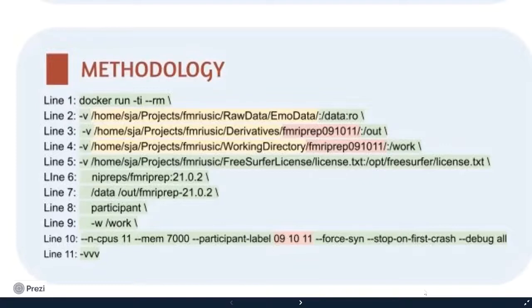This is an example of one of the fMRI commands that we ran on the ASDRP server through the use of publicly available Docker containers, which contribute to the reproducibility of our results.